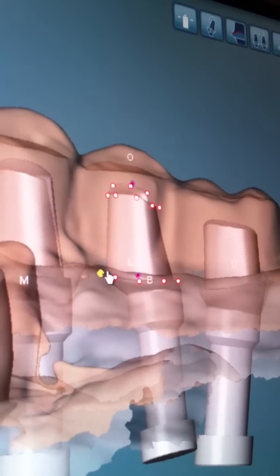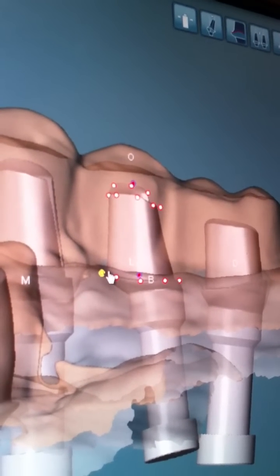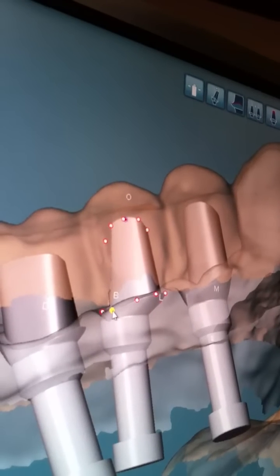Well, the thing about it is that whenever you have an implant that's not in exactly the location you want, if they would drop the implant deeper, it always helps, whether it's to lingual, to facial, wherever, just go deeper. But then again, you get close to the sinus in this position. So there is a limit. Then you end up with a shorter implant, and you're better off not doing that on the maxilla. It's a two-sided sword. Unfortunately.